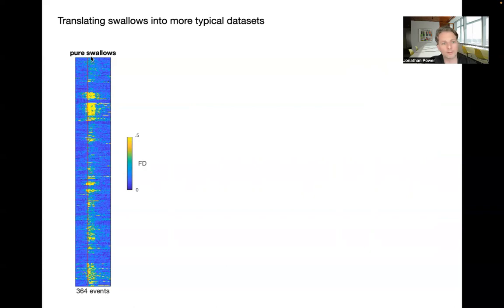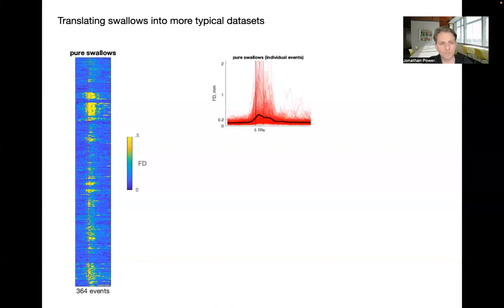So when you look across this, what you see is bands of low motion, high motion, low motion, high motion, which gives you a sense that there's going to be a subject by subject structure to this, because some of these groupings are subject by subject. The point that I'm driving at is that swallows are usually associated with motion, and often a whole lot of motion.